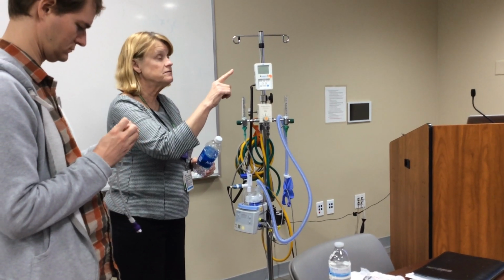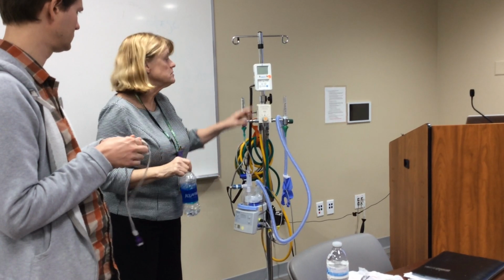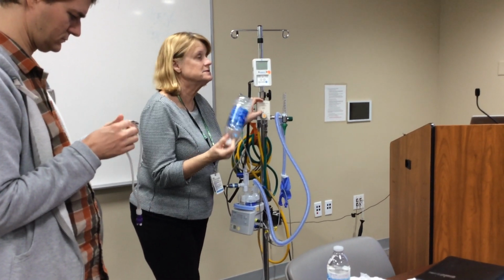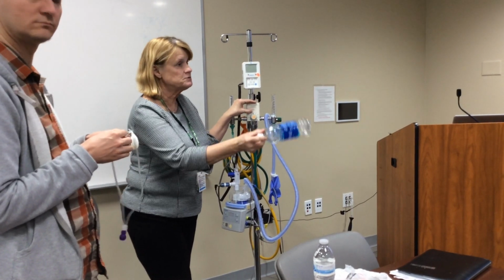We're increasing the liter flow to blow out the trapped air. Yeah, the CO2. That's what I want to confirm. Like I said, you and I, minute ventilation on everybody on this planet is about 5 liters per minute. So if we start at 6 liters, and that's what you're going to see down there.